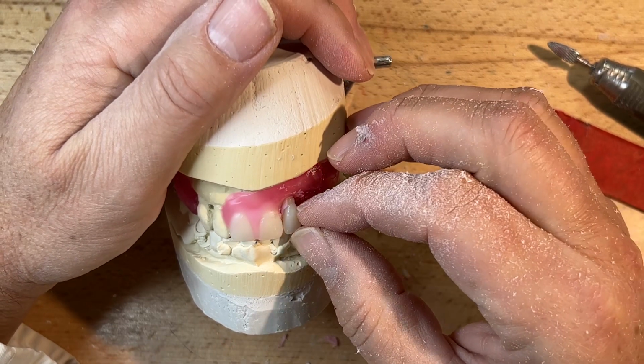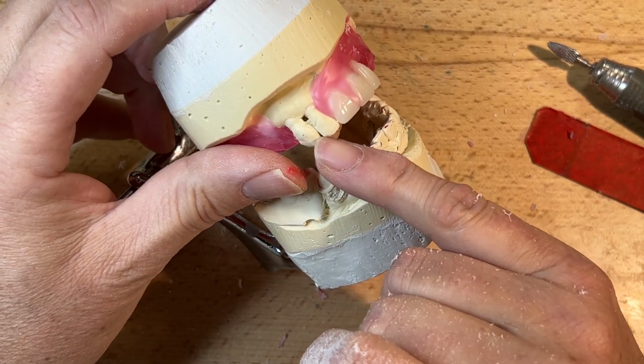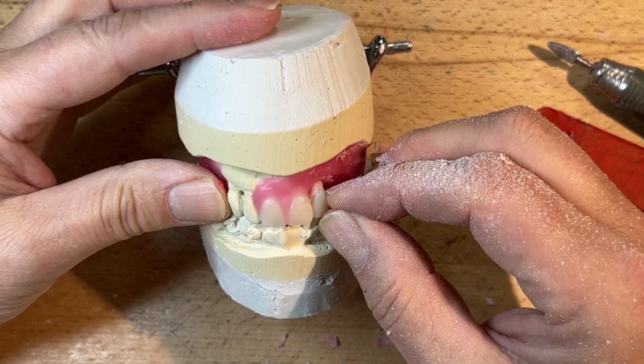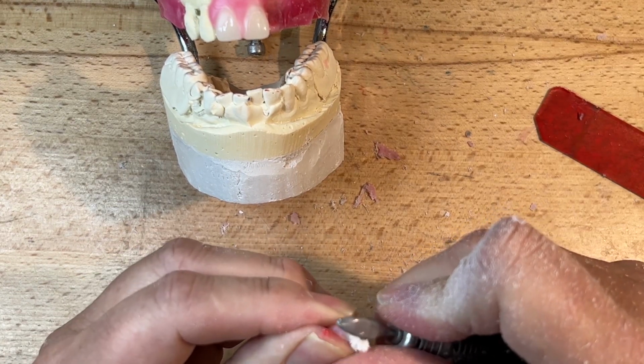And you can see we've picked some denture teeth with the same character as this here. Now, a very feminine distal incisal edge of the lateral, kind of reduced. So we're going to keep the same character. It doesn't have to be symmetrical. Sometimes asymmetry, obviously, is a little bit more pleasing to the eye.